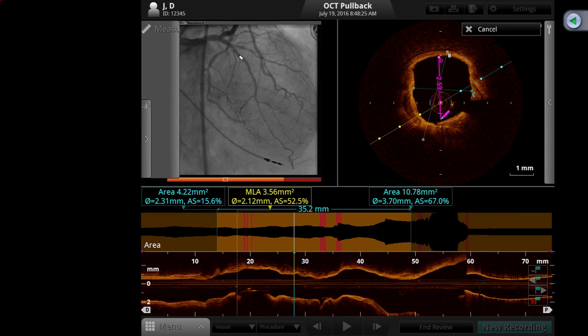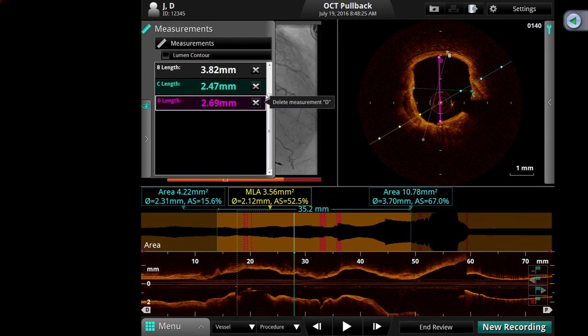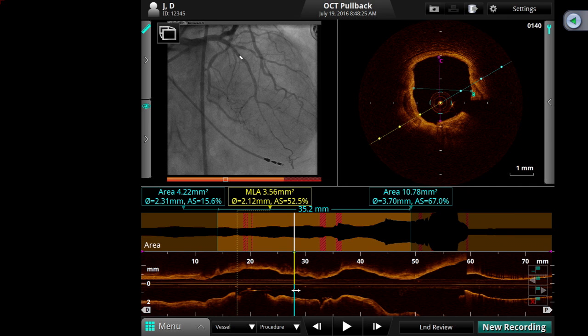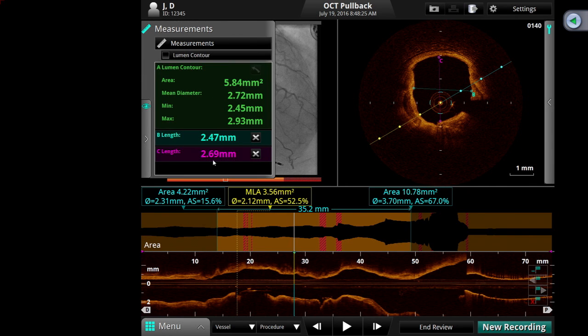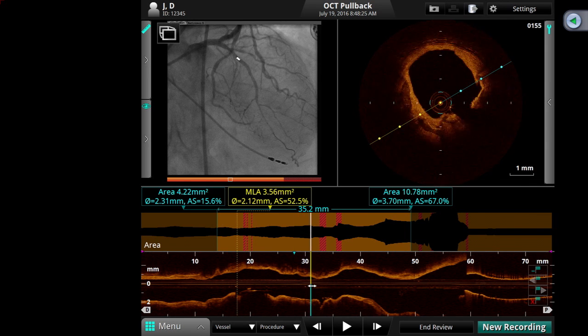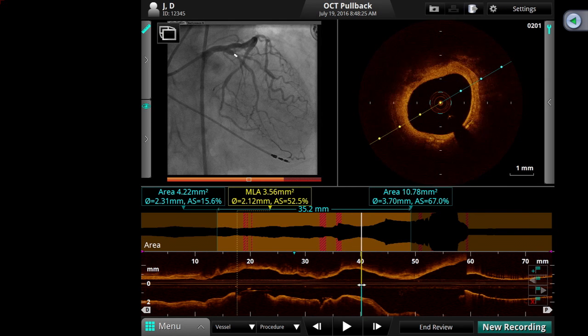What, 2.5? It's giving you 3.0. Probably 3.0. Okay, look at it visually. Visually that doesn't look good. The B is 3.8. You went too far. I think it's the length. No, it's not length. Look at the B. So the lumen is 2.5 and 2.7. Wow, that's surprising, because visually the diagonal looks like 3.5. I know. That's surprising, usually it's the other way around.